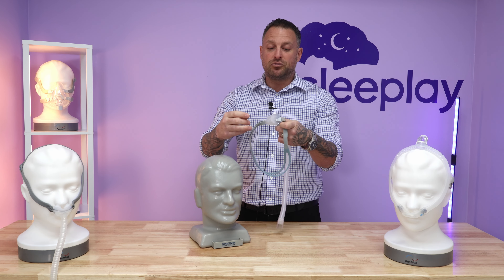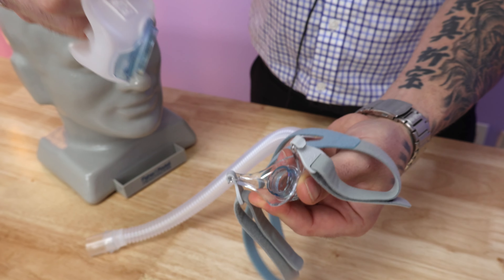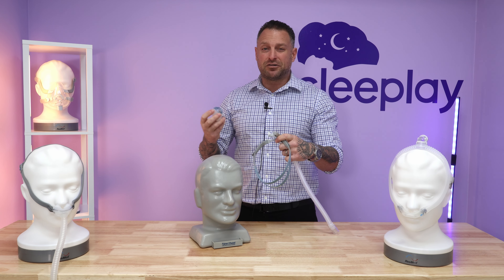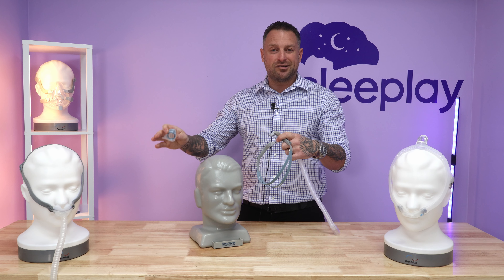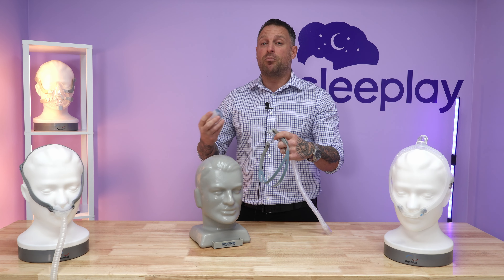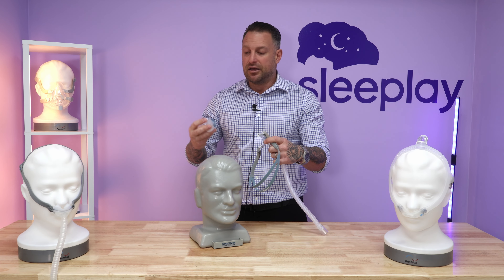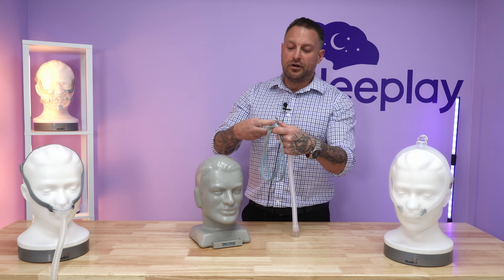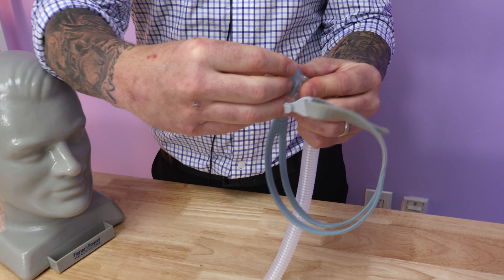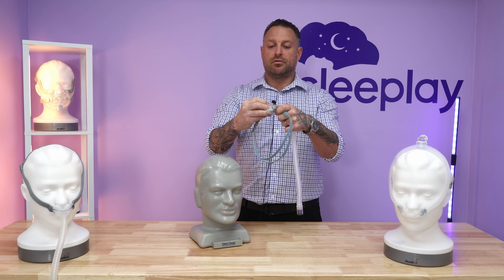This is very easy to take off as well. There's a frame here — you can see where the gap is in between, and you just literally pull this off. These are a little softer pillows as well. If you want something a little softer instead of the P10 pillows, which are a little more stiff, this is a good option. With all masks, it is your comfort choice and whatever your preference is, that's what works for you. To put it back on, it says F&P Brevida on the top bridge of the frame, and you just clip it back in and hear it snap.